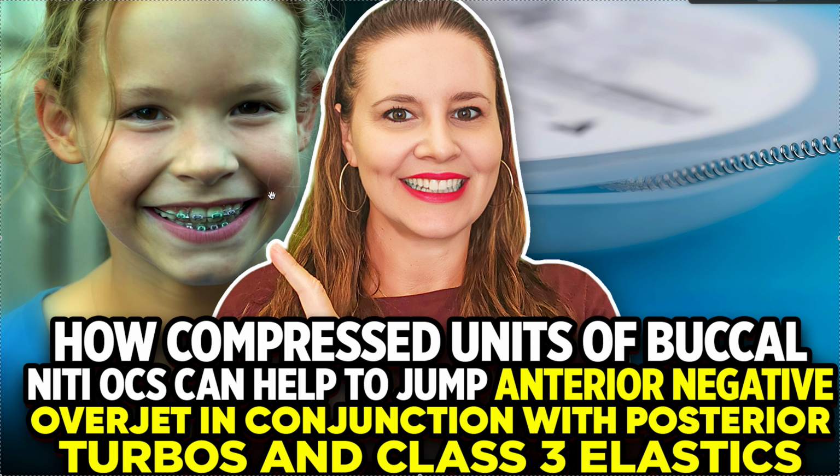So 2 units of compressed NiTi open coil spring, and either a cinch in the back on the wire. That means you're going to have to heat it up, measure the coil, put the coil on both sides, feed it in, and then cinch it. And if you made it too long, you're going to have to take it out and repeat back and forth until you get it right. Or the appliance on the inside. And that's really all you do. It's really easy. It should jump no problem, assuming you did everything right. Don't forget those bite bumps, super important.